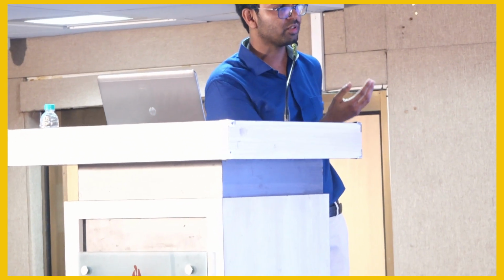You have a pump flow usually around 3 to 4 liters per minute, but based on body weight and requirement, we can go up to 7 liters also. We try to maintain the sweep gas flow to blood flow ratio at 1:1. That will give you a CO2 of around 40 to 46, but it's not always true. We have to monitor the patient's ABG, and we have to manage the sweep gas flow accordingly.